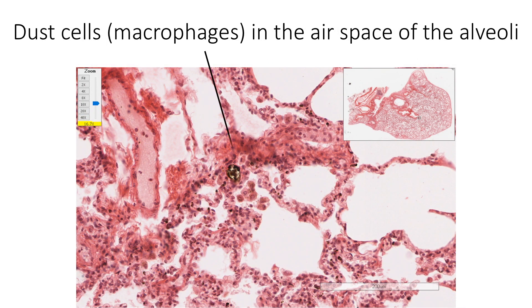A third type of cell is also found in the respiratory zone: dust cells, or macrophages, found in the air space of alveoli as shown here, and also in the connective tissue of the interalveolar septa. These cells phagocytose inhaled dust particles — hence named dust cells. They also phagocytose red blood cells from capillaries in congestive cardiac failure, resulting in rusty sputum, and are therefore also called heart failure cells.